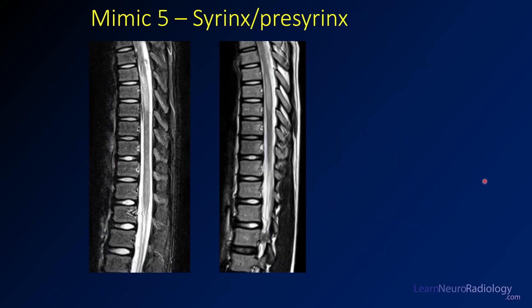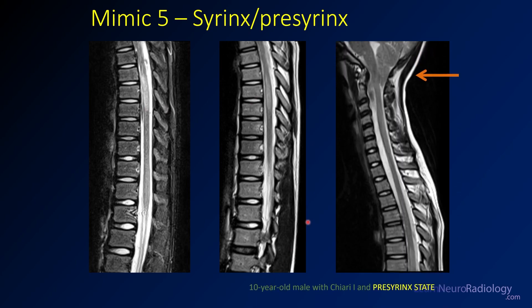Mimic number five is syrinx or pre-syrinx. A syrinx involves either expansion of the central canal or edema around it, most often related to CSF flow abnormalities. In this mid-thoracic spine case, we have T2 abnormal signal on both fat-sat and non-fat-sat sequences. Looking at the cervical medullary junction in this 10-year-old, there's a Chiari malformation with very low cerebellar tonsils. The abnormal CSF flow caused by compression at the fourth ventricle outflow tracts is producing the syrinx distally. Be sure to look at the rest of the spinal cord for CSF flow abnormality clues.